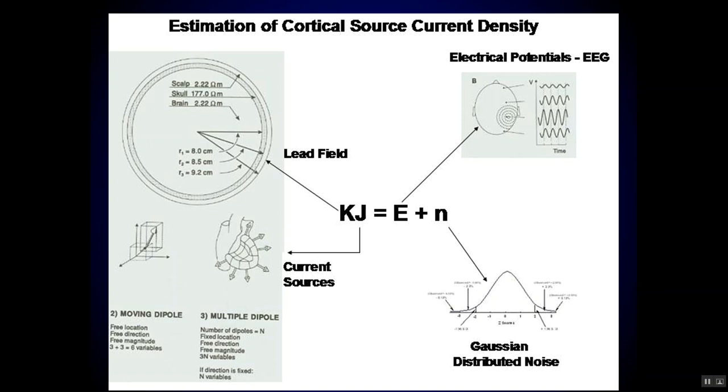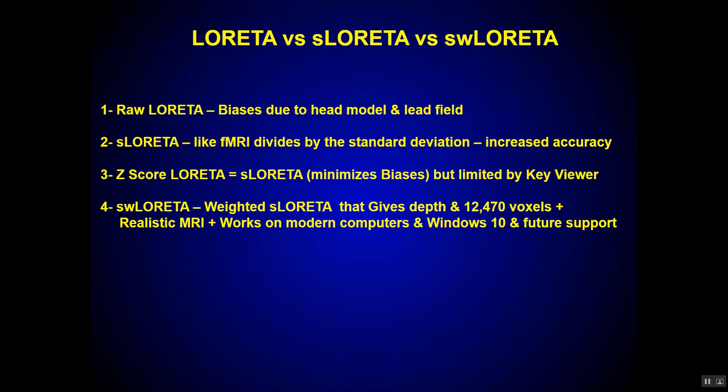It's the inverse solution. And there's a lot involved in the mathematics of that. You have to have physiological constraints, otherwise there's an infinite number of solutions in vector calculus when you divide by a value to get an inverse. So you constrain it in a variety of ways. Roberto Pascual used the Laplacian transform. We're not going to go into details on that.